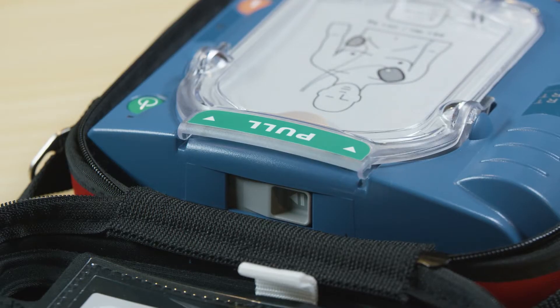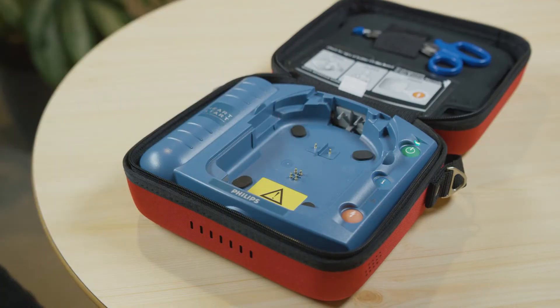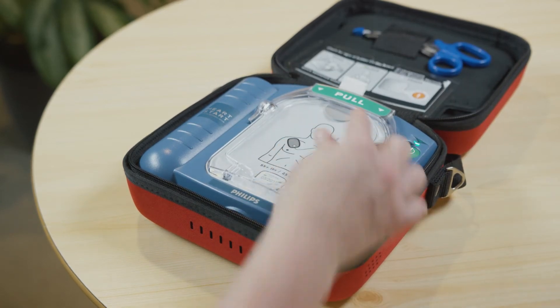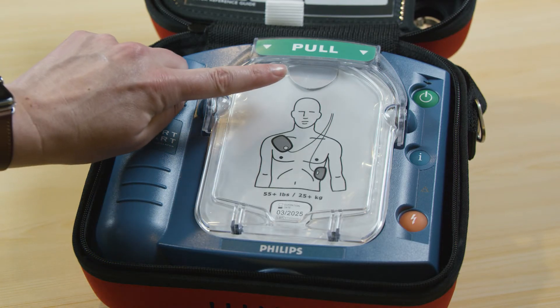When it comes time to replace the pad cartridge, slide this lever to pop out the old pads and drop in the new pads, placing the bottom end of the cartridge into the compartment first and pushing down until it clicks. Make sure you don't open the film seal of the cartridge until you need to use the pad.